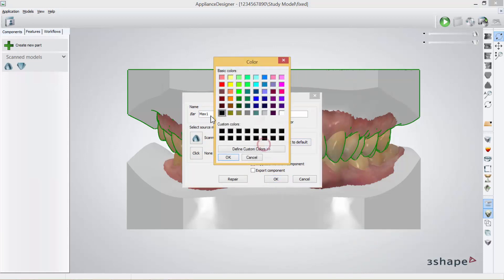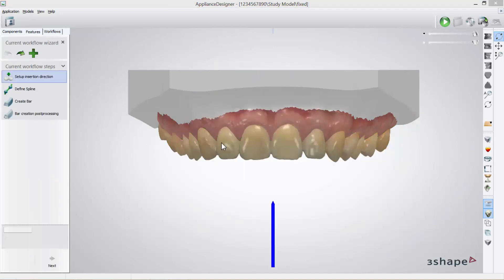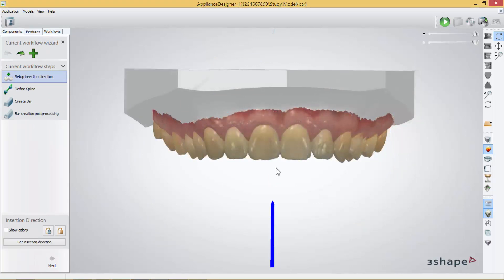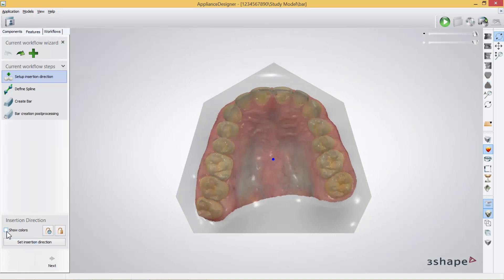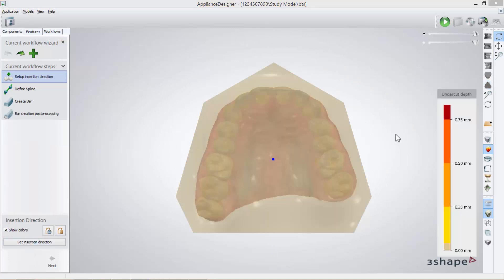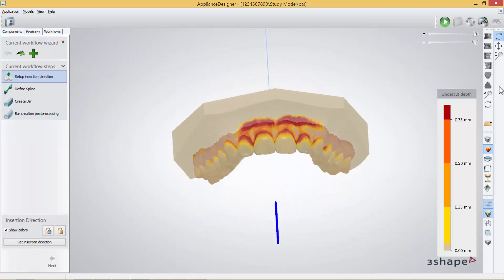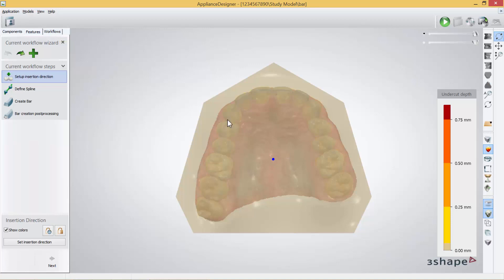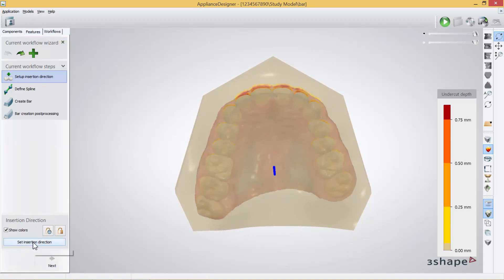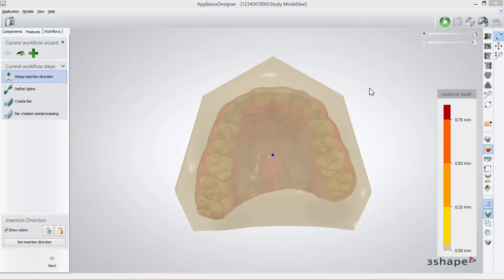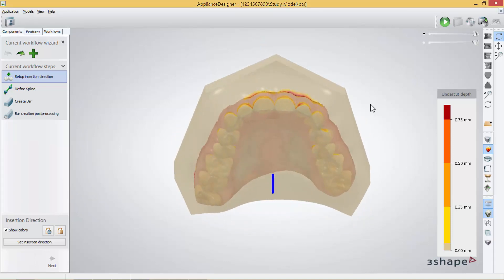For coloring I will choose this one and take a different color if I want to. Press OK and you can now begin to create a bar. In the first part we can set the insertion direction of the appliance we are about to build. When I turn over the model and press Show Colors, it will give me all the undercuts of that particular model. If I want to change the insertion direction I will just move my model a bit and press Set Insertion Direction and the undercuts will be different. If I am satisfied with this insertion direction I will press Next.